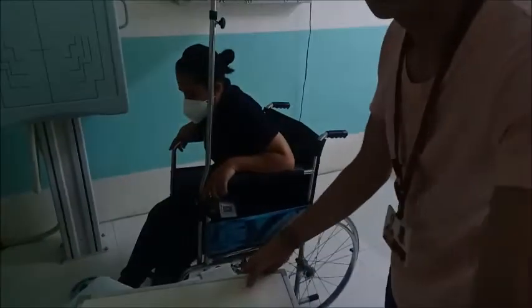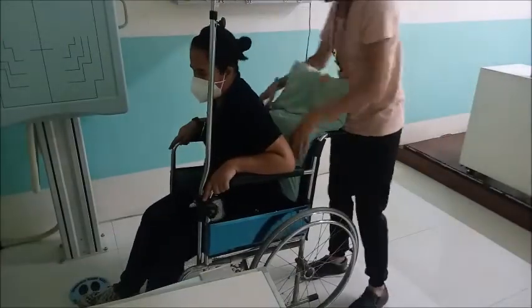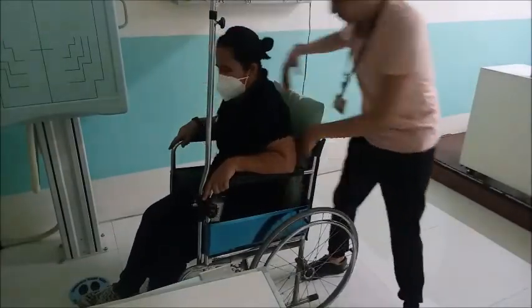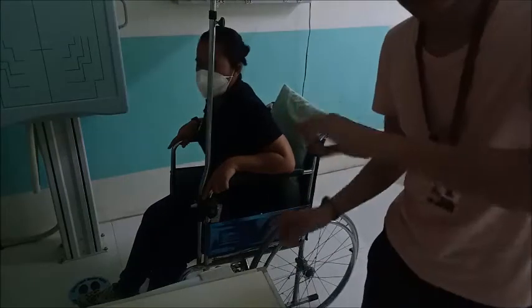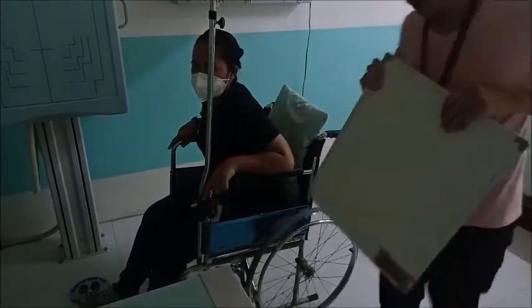Na, dili sila sumpay. Insert pillow. So, ang inferior portion sa pillow is naka-pillow towards the buttocks of the patient.